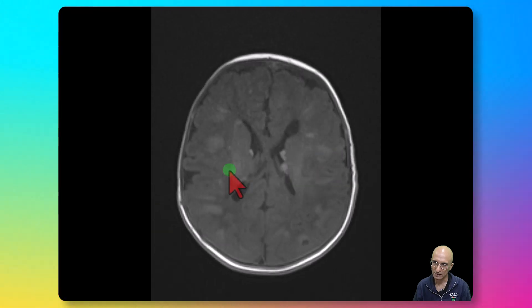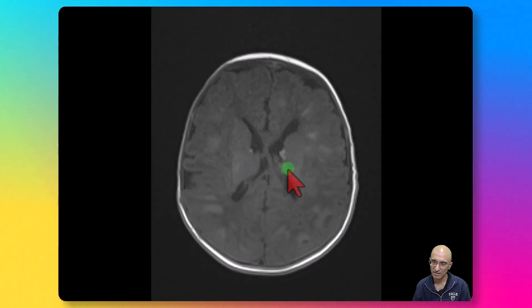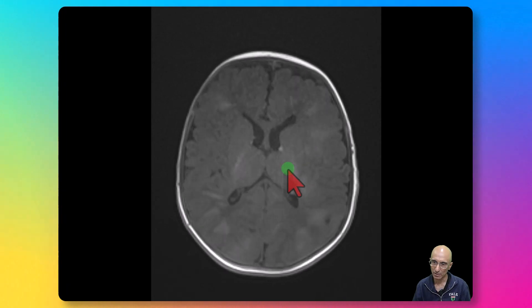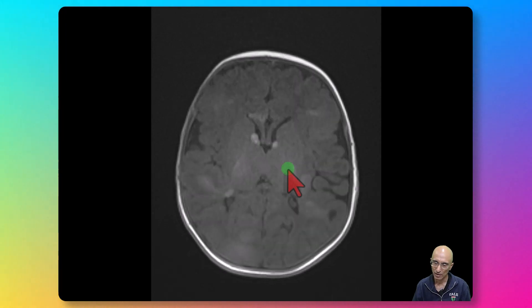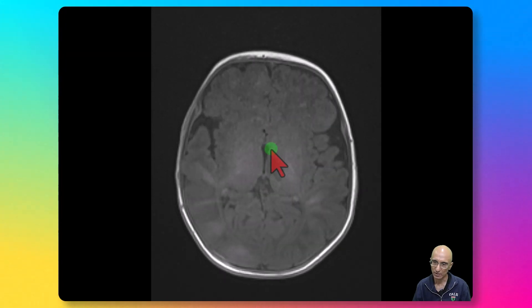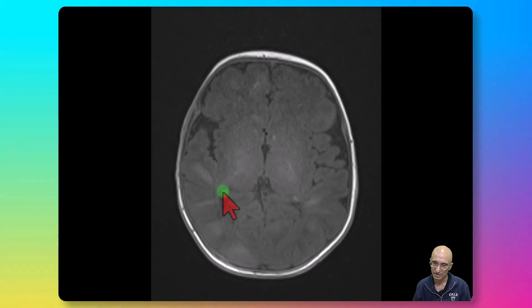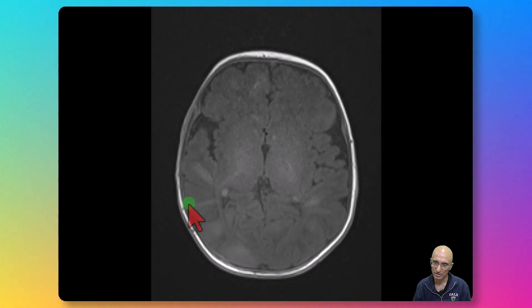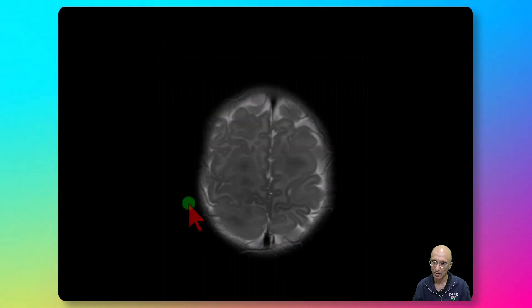Another radial hyperintense lesion extends from the sub-ependymal region to the sub-cortical regions. We can see multiple T1 hyperintense sub-ependymal nodules in the region of bilateral foramen of Monroe. Again, multiple white matter high signal lesions and multiple radial bands extending from the cortex to the sub-ependymal region.